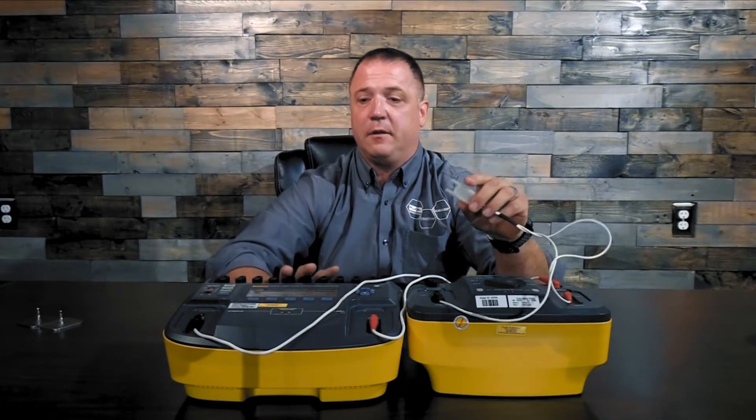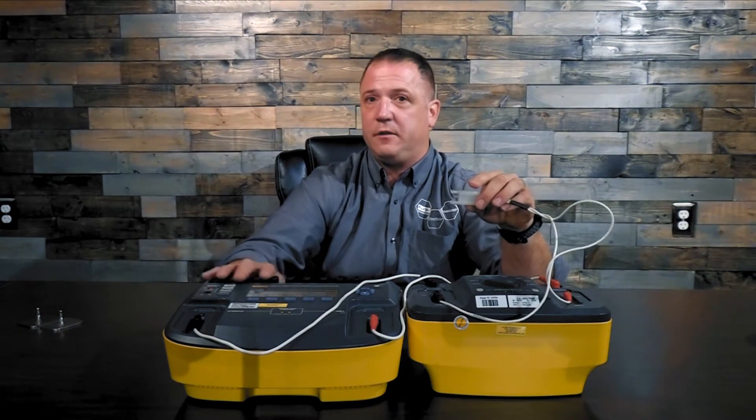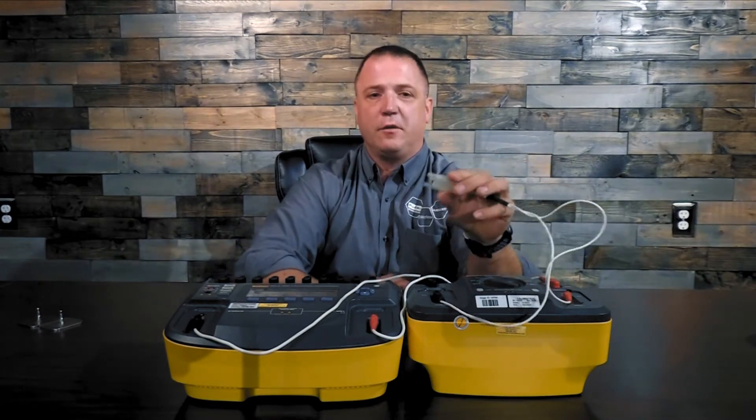That's all you really need to do for the energy output test. Some people prefer to hook up their ECG leads — that's up to you and your service manual.